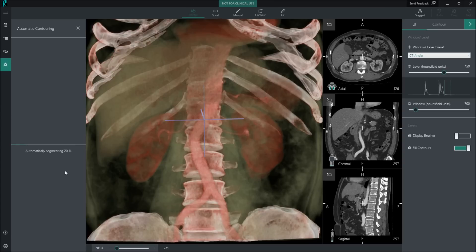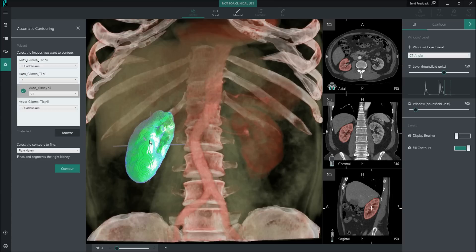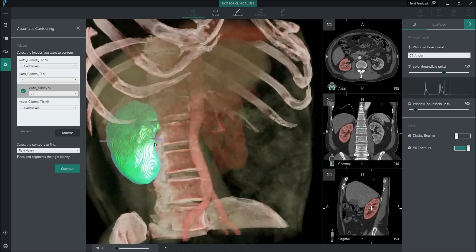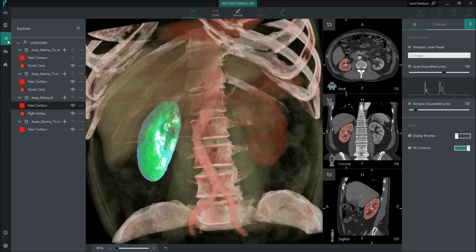Here, we apply the same machine learning model on a CT scan. We have loaded another decision forest that was trained on recognising kidneys, and it is running now in the background. Just like before, every voxel in the image has been classified as belonging to the organ of interest — in this case the kidney — or everything else, the background. The segmentation here is obtained completely automatically in just a matter of seconds.